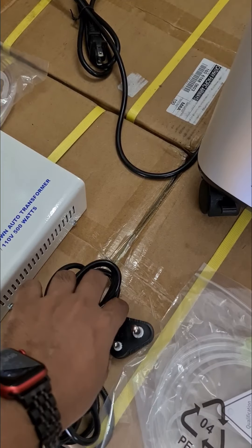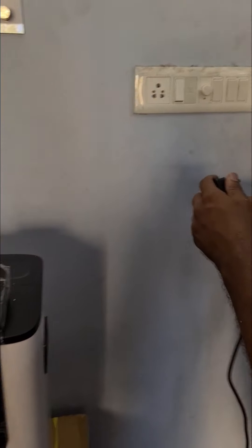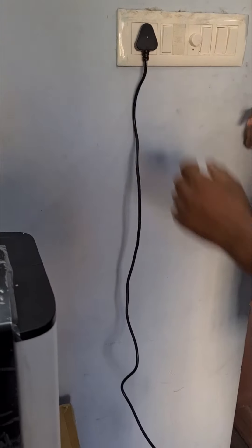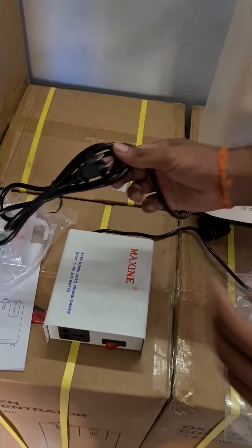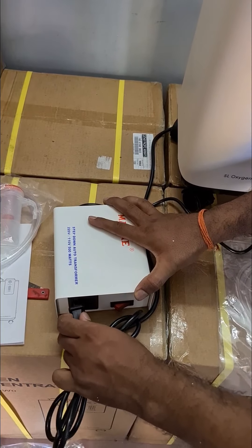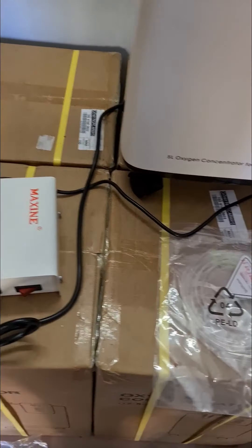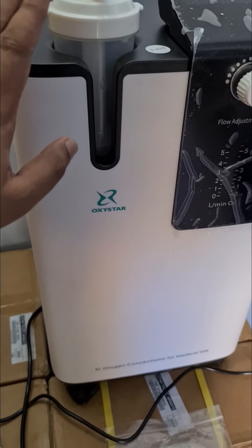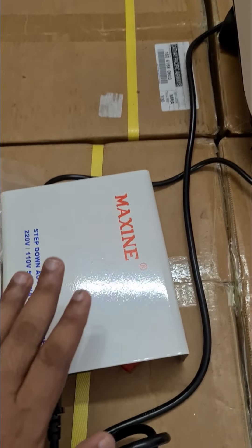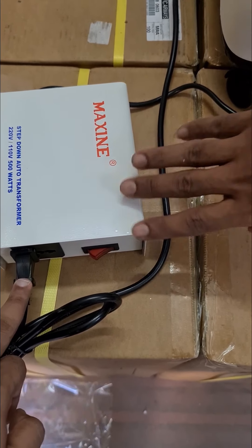Now he is going to connect this to our normal electrical main supply — to a standard 5-amp plug. And then he is going to connect the machine cable to this transformer. Again we repeat, don't make the mistake of thinking you can put this directly into a travel adapter — the machine will instantly fail. This machine requires 110 volts, so the duty of the transformer is to step down the 220 volts to 110. He has connected everything properly now.